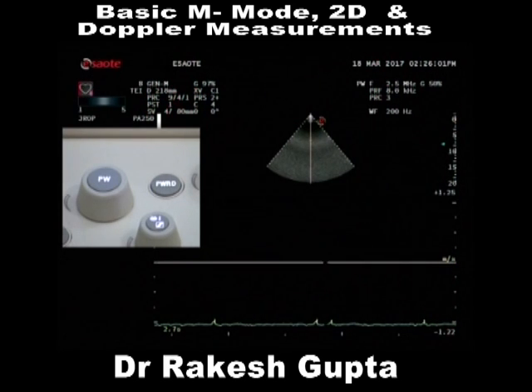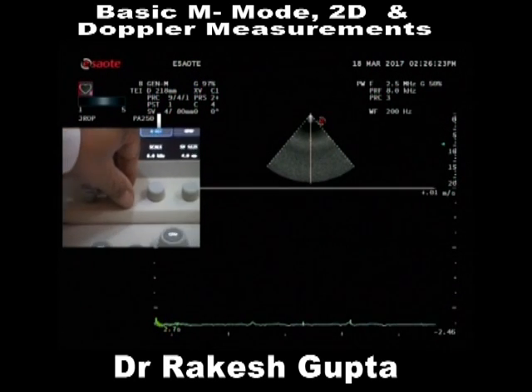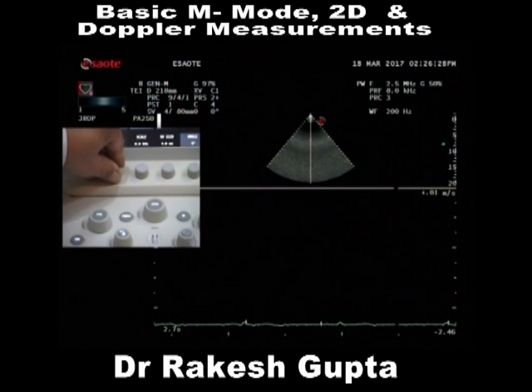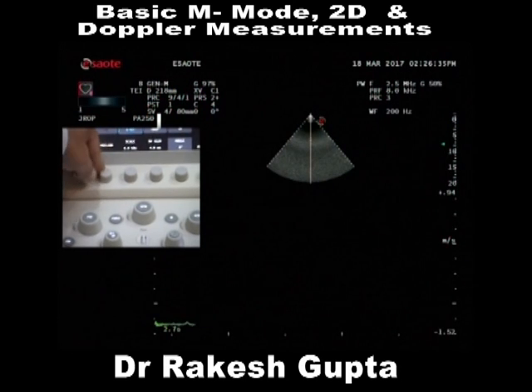How do you say this? Now look at the scale over here. The pulse wave velocity scale is 1.25 over here, 1.22 over here. So how much maximum velocity will it measure? 1.22 plus 1.25. Suppose I take my baseline up. Now this is the maximum, so it can measure up to 2.46. So any velocity up to 2.46 you can measure.